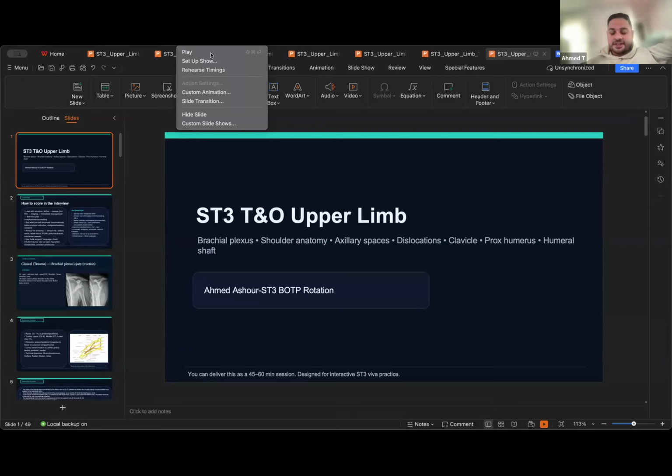Always check the ATLS. Just get it out of your mouth. Open injury, skin compromise, polytrauma. So your default spiel, should you describe your X-ray as my colleague have mentioned, say this is an AP or lateral radiograph of unknown demographics of a skeletal mature individual showing the right shoulder. The most obvious finding I can see is that, and then rule out fractures, soft tissue, and others.